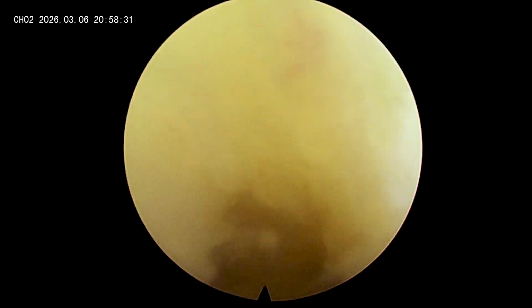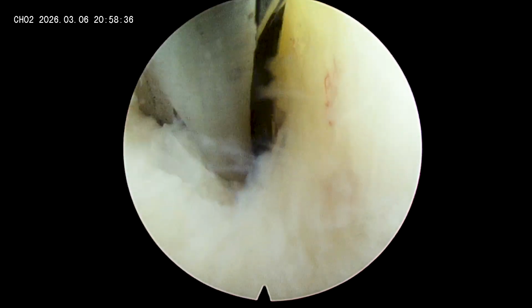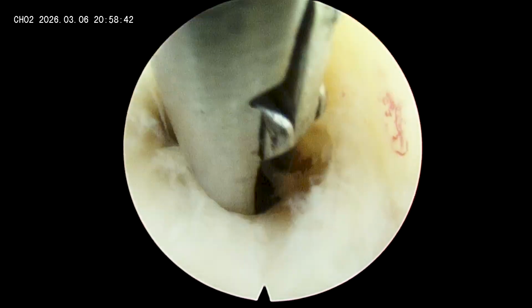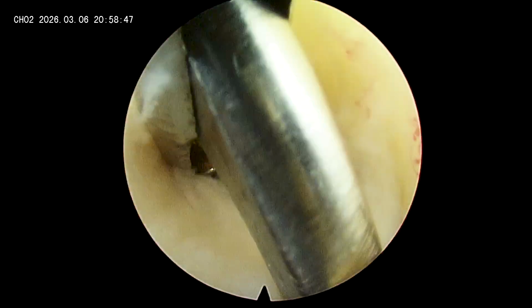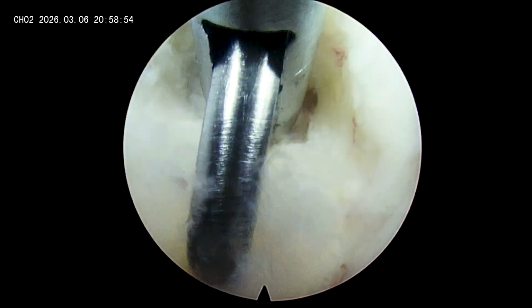Once you reach the deeper layer, here you can see the color of the ligamentum flavum is changing. So the deeper layer will be more pinkish or more pale, whereas the superficial layer will be more yellowish. So you can say I am already into the epidural space. You can see the epidural space here.